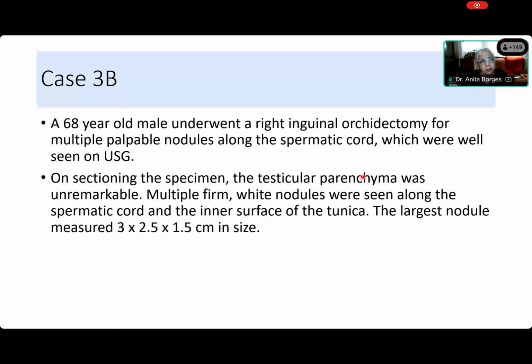Okay, Chandana, are you there? You're there? Anyway, you didn't get this case. I just wanted to present it; you don't have to answer the questions. This was a 68-year-old male who had a right inguinal orchidectomy for multiple palpable nodules along the spermatic cord, and they were seen on ultrasound.